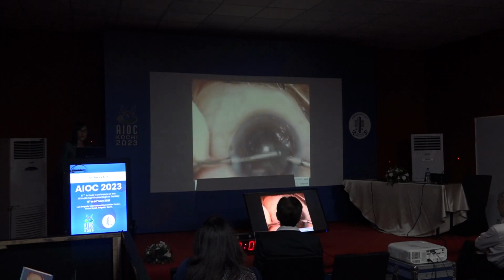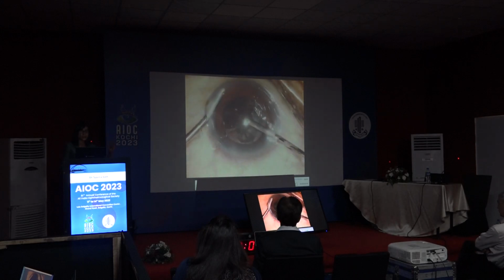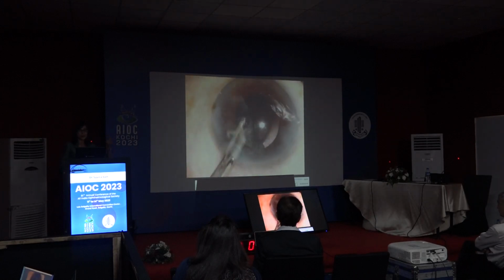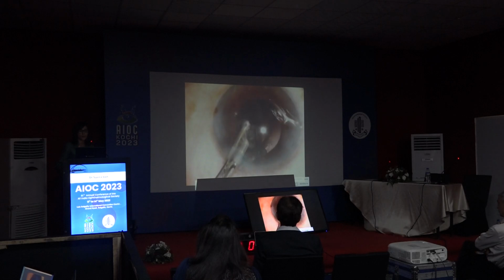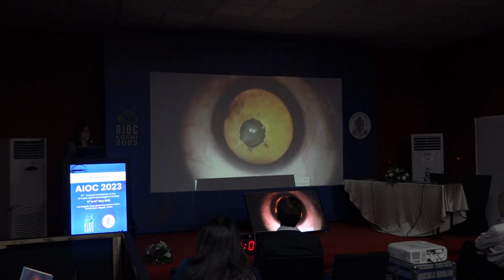This is quite an old video. I managed with a play between IA and also dry aspiration of the last part of the cortex under viscoelastic, and there was no vitreous disturbance, which gives you a certain extra element of safety.